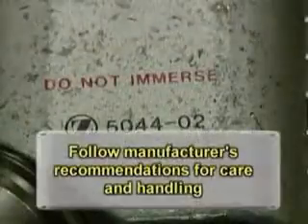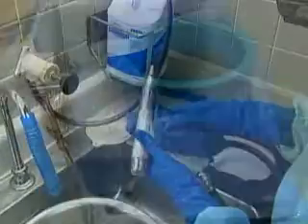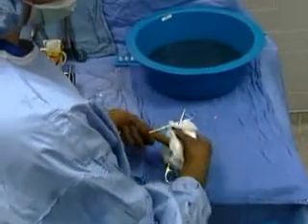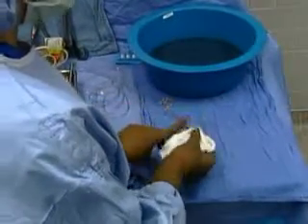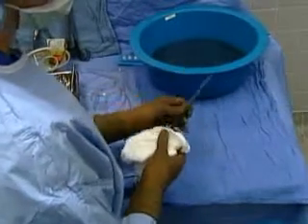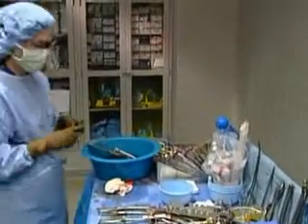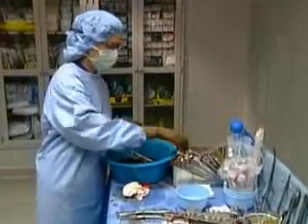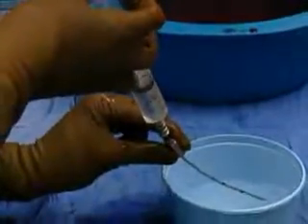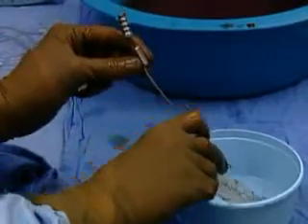The care and handling of surgical instruments should follow the recommendation of the manufacturer. Cleaning and decontamination begins the moment an instrument is used in the operating room, with the scrub person wiping the gross soil from the instrument with a sponge moistened with sterile water. Instruments should be kept free of gross soil during the surgical procedure. Instruments with lumens should be kept patent by irrigating them with sterile water.